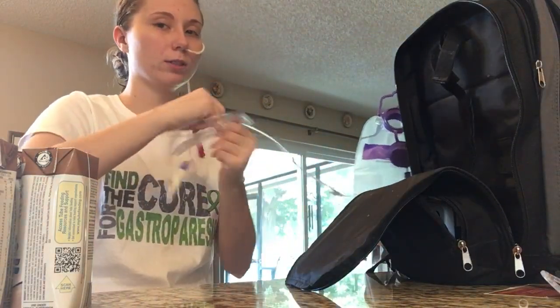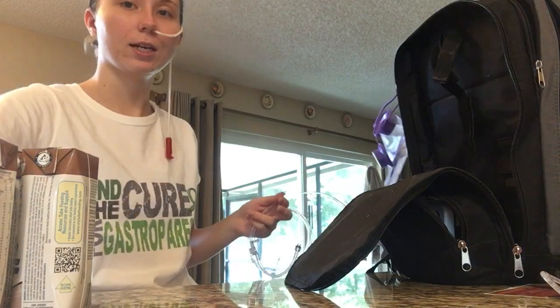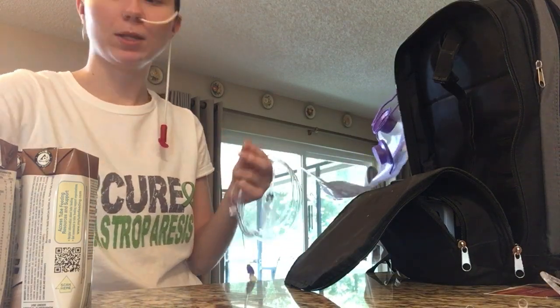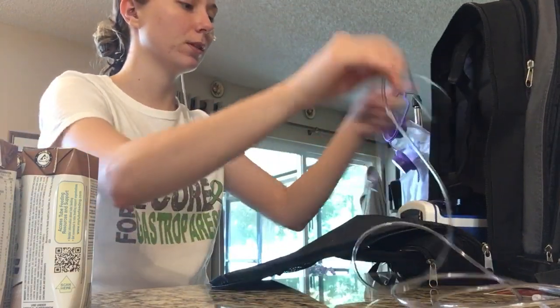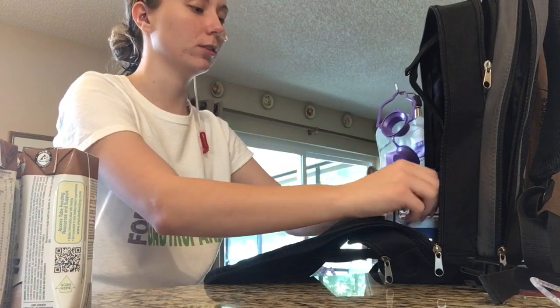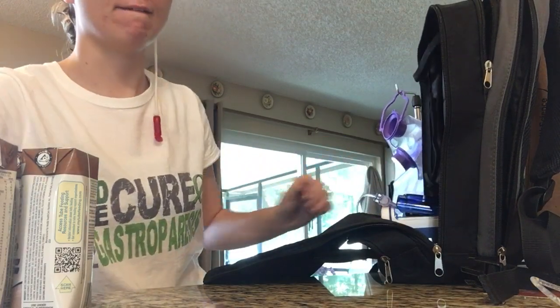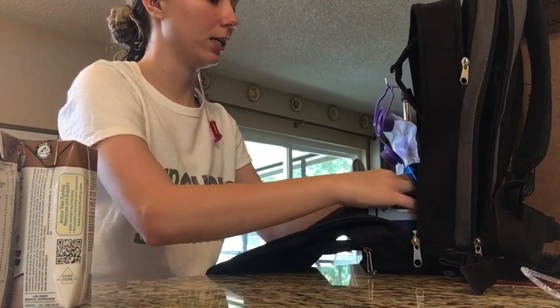So I put this here. I'm going to take the cord, take all the tape off of it, and then I'm going to start setting it up in the pump. The feeding tube pump that I have is a Kangaroo Joey. It just does one bag of formula. It doesn't have the option to do a bag of water for flushing. And then as you can see, I'm putting it in here. I'll do a detailed video on how to work your pump. So I'm setting that up.